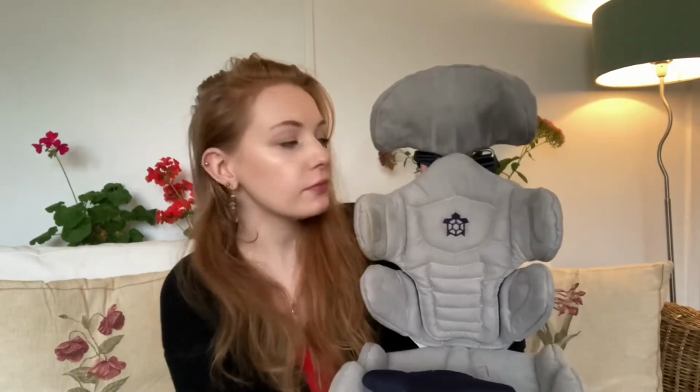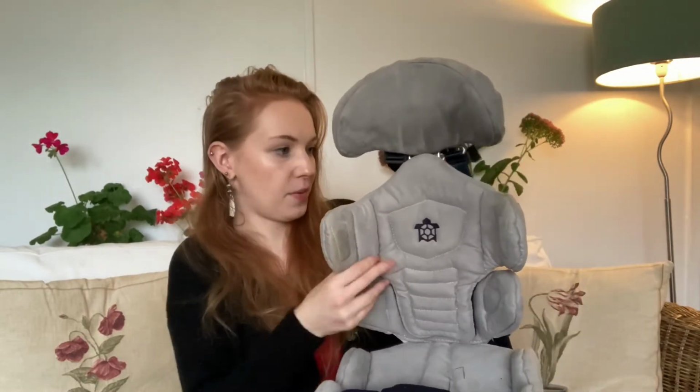The next thing that we have for Robin is a specific chair. Because she can't sit up independently, quite clearly you can't just pop her in a normal high chair. So instead of a high chair, she has this seat. If you've followed us for a while, I'm sure you've probably seen this in action. But this seat helps support her shoulder. It brings her shoulders in, it supports her head, it supports her hips, and you can obviously strap her in so she's nice and safe and cozy.